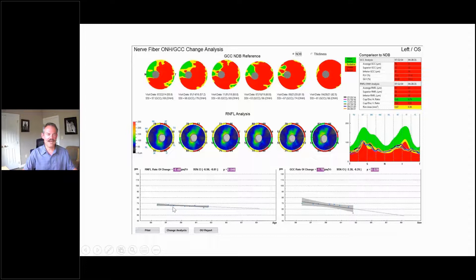The left eye is also being flagged from a nerve fiber layer standpoint. I'm concerned with the left eye that the patterns, especially the infratemporal pattern, are changing as time goes by. The ganglion cell complex is being flagged.